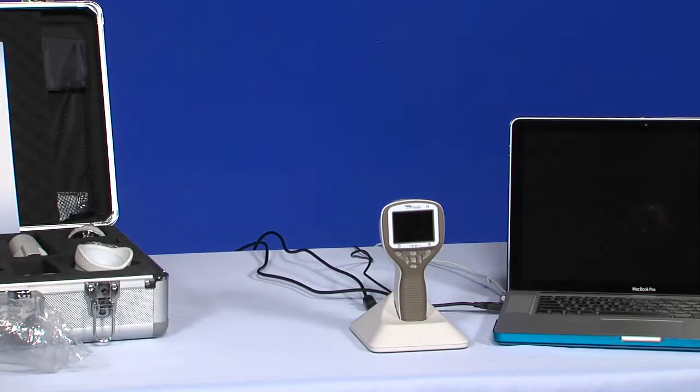When the device is not used, it may be stored in the cradle and recharged with or without a module attached.